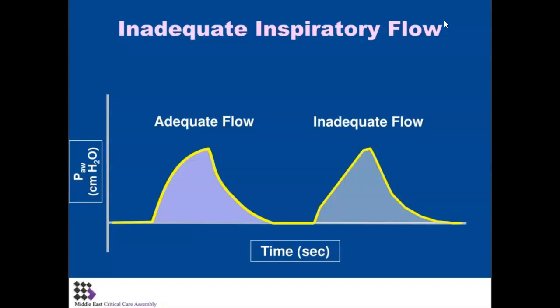Okay. Once I plug those in, and again, you're just kind of guessing a little bit. You're going to be setting something within a normal range, but you are not going to know if that's appropriate for the patient until after you set it. Okay. So what you need to look at after you set your flow rate and when you're doing that initial vent check is I always look at my pressure waveform. Okay. What my pressure waveform should look like is the picture or the scalar that's on the left hand side of the screen. Okay. See how it's kind of rounded upward on the left side of the peak.